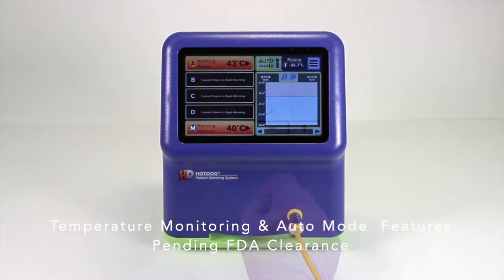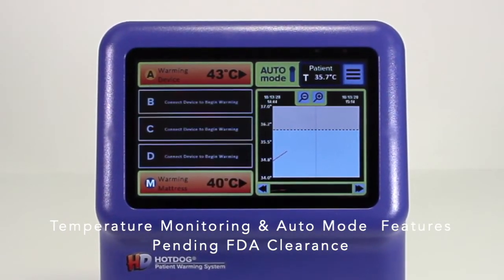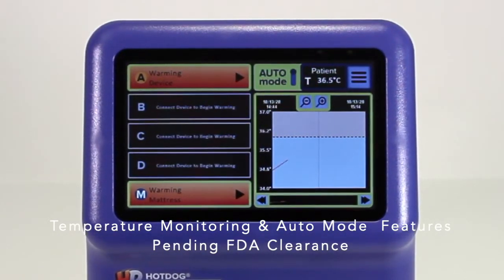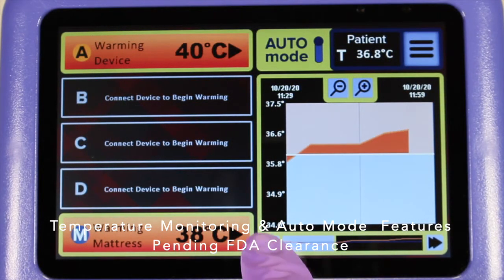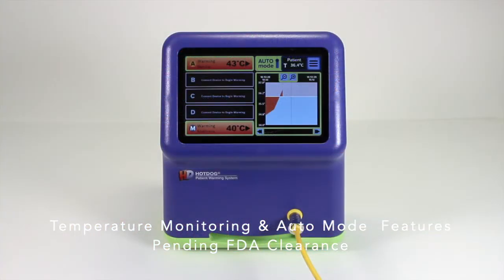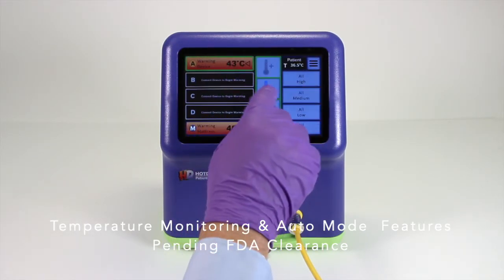As the patient's core temperature moves through the normothermia zone when auto mode is engaged, the temperature settings on the warming devices are gradually turned down. When the top temperature in the normothermia zone has been reached, the controller will place the warming devices in standby mode. They will automatically turn on again if the patient's core temperature falls while in auto mode. To turn off auto mode, touch the auto mode icon at the top of the screen.